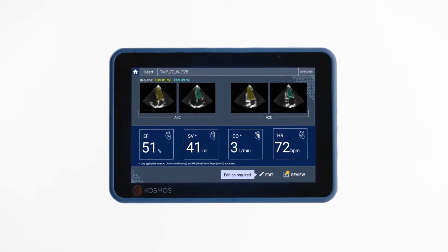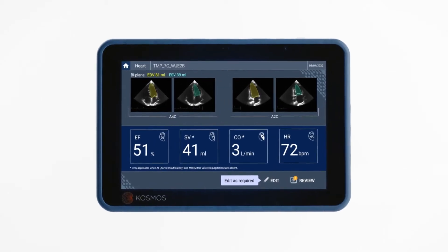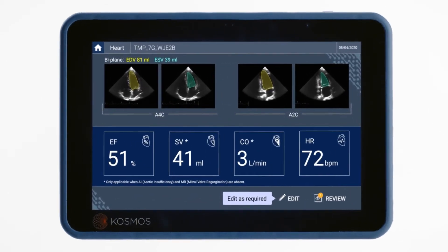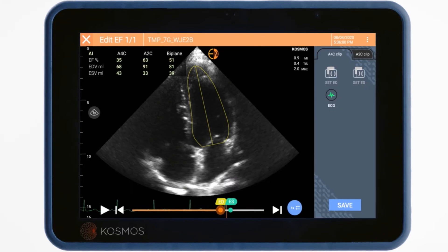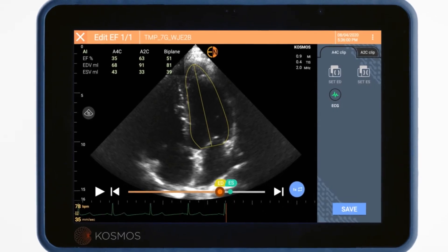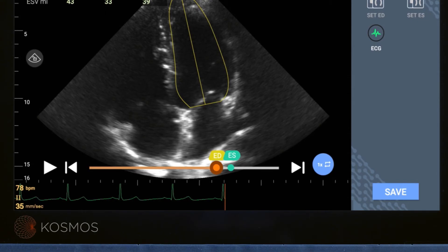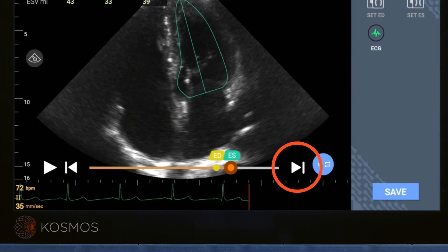To review the left ventricle tracing, tap any of the thumbnails in the results screen. Use the cine bar at the bottom of the image to scroll through the clip.